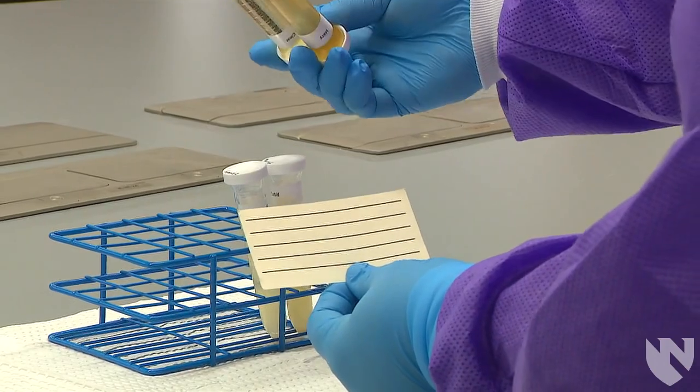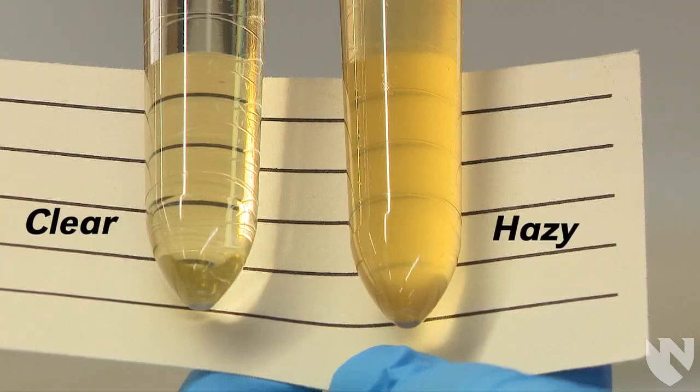Now let's compare the urines directly. First, here is a clear urine versus a hazy urine. Notice with the hazy urine, you can still see the lines but they are not as clear compared to the other urine.